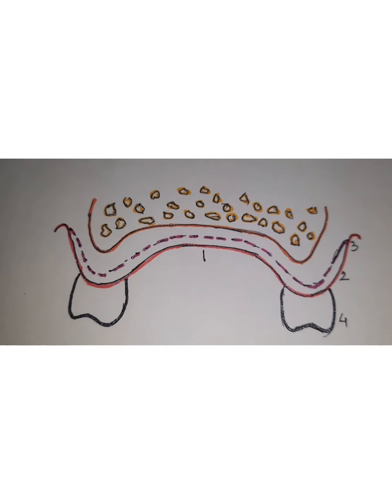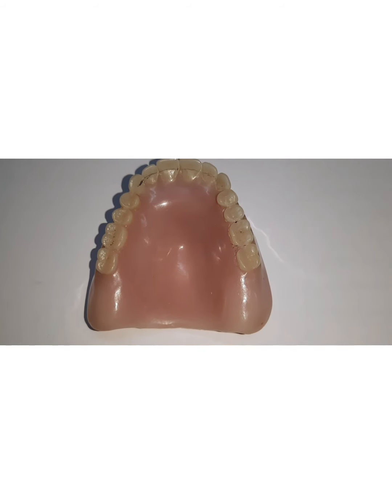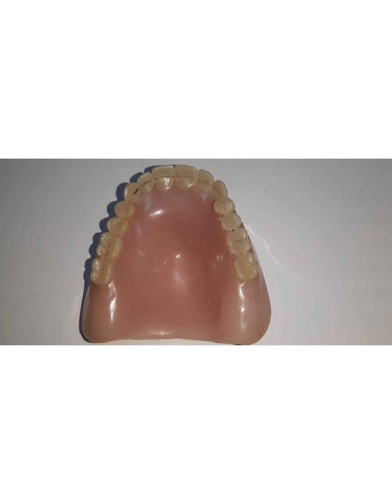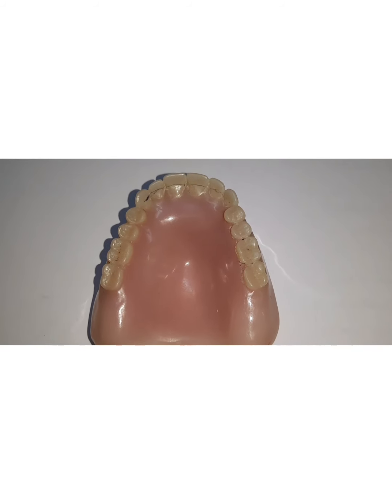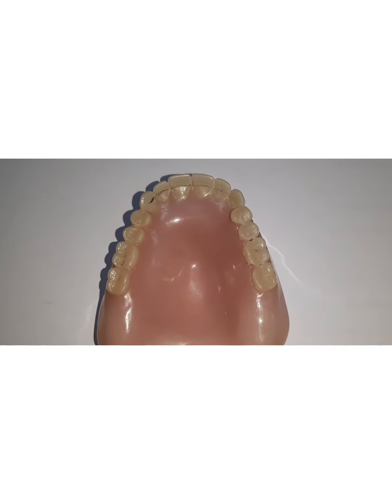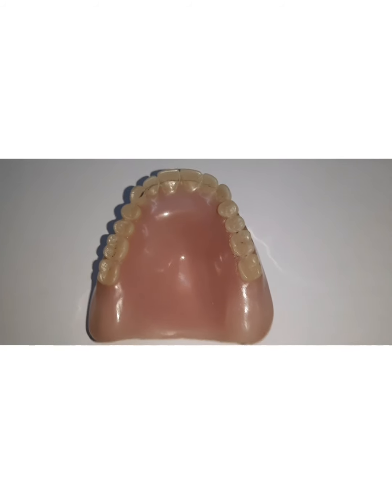the aesthetics. So denture base can be made up of acrylic resins. Mostly it is made up of acrylic resin. They can be metal based denture bases also. Some of the most commonly used metals are gold and gold alloys, type 4, cobalt chromium alloys, and nickel chromium alloys, which can be used for making metal based dentures.